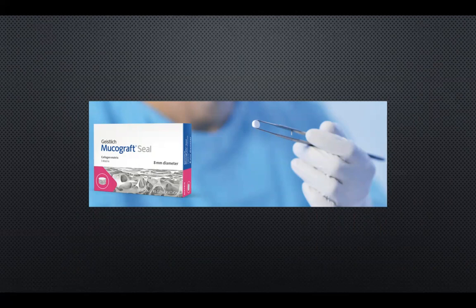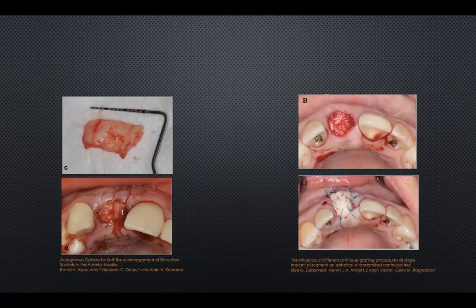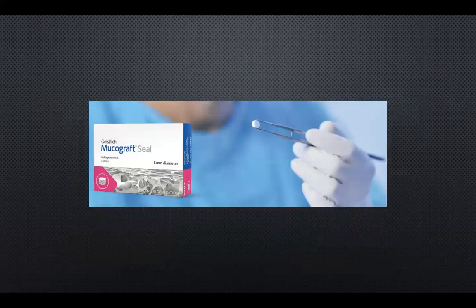You place it like this, same thing. You put it here, you seal the socket with it, and you close over it with either simple interrupted sutures or crisscross sutures. And they claim that it will enhance the soft tissue healing, thickness wise, and will compensate for some contraction that will happen.